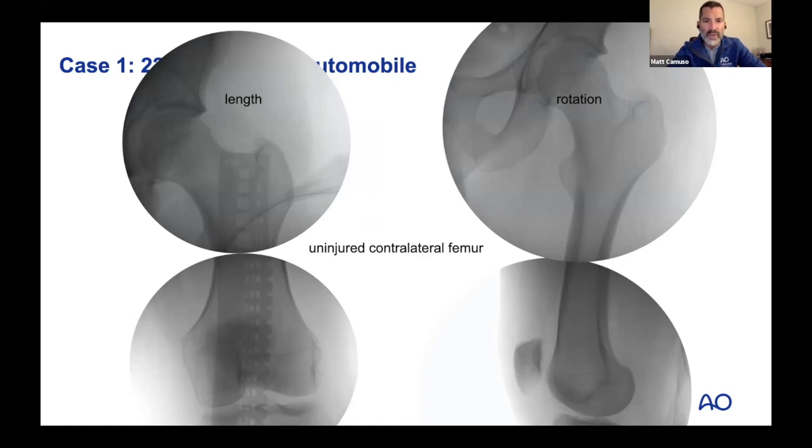We then keep that rotation of the limb with perfectly overlapping condyles and rotate the C-arm up to perfectly vertical, so 0 degrees, and then slide up and take an AP of the hip, centered on the hip, centered on the lesser trochanter. And what I'm looking at there is that lesser trochanteric profile. And I save that on the C-arm screen because I'm going to use that later to compare the rotation of my injured side as I start to interlock the nail.